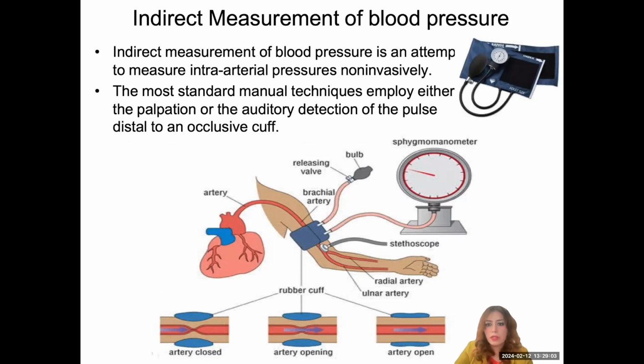Indirect measurement of blood pressure. So this is an attempt to measure the intra-arterial pressures non-invasively. The most standard manual techniques employ either the palpation or the auditory detection of pulse distal to an occlusive cuff.